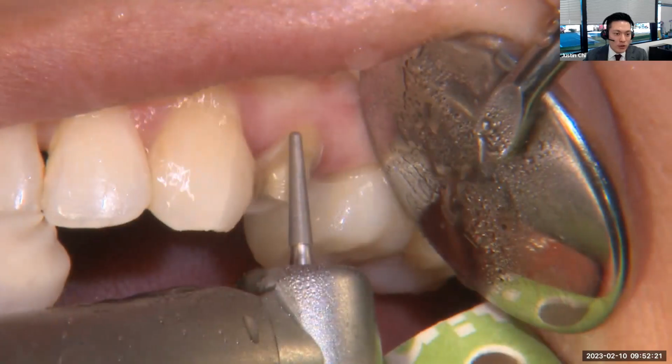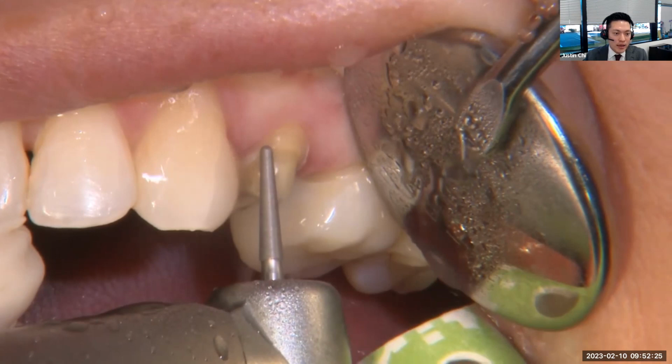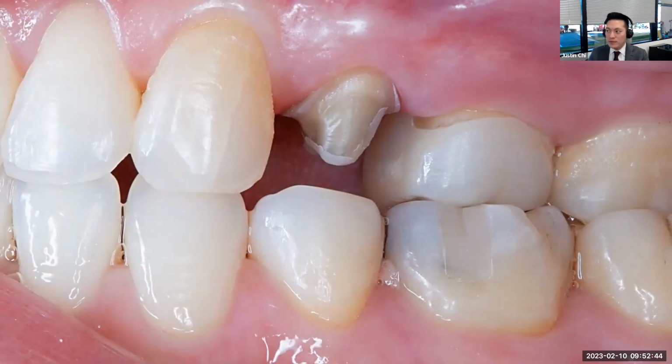Now, the preparation: using a round ended tapered diamond, trying to drop those margins at least equigingivally, especially in the aesthetic zone on the visible sides of the tooth. If it's on the lingual and I don't have to do it, I won't, but I drop it on the buccal so we have a cleaner, hidden transition from our prep to the design to the restoration. So here's our final prep from the buccal and lingual.